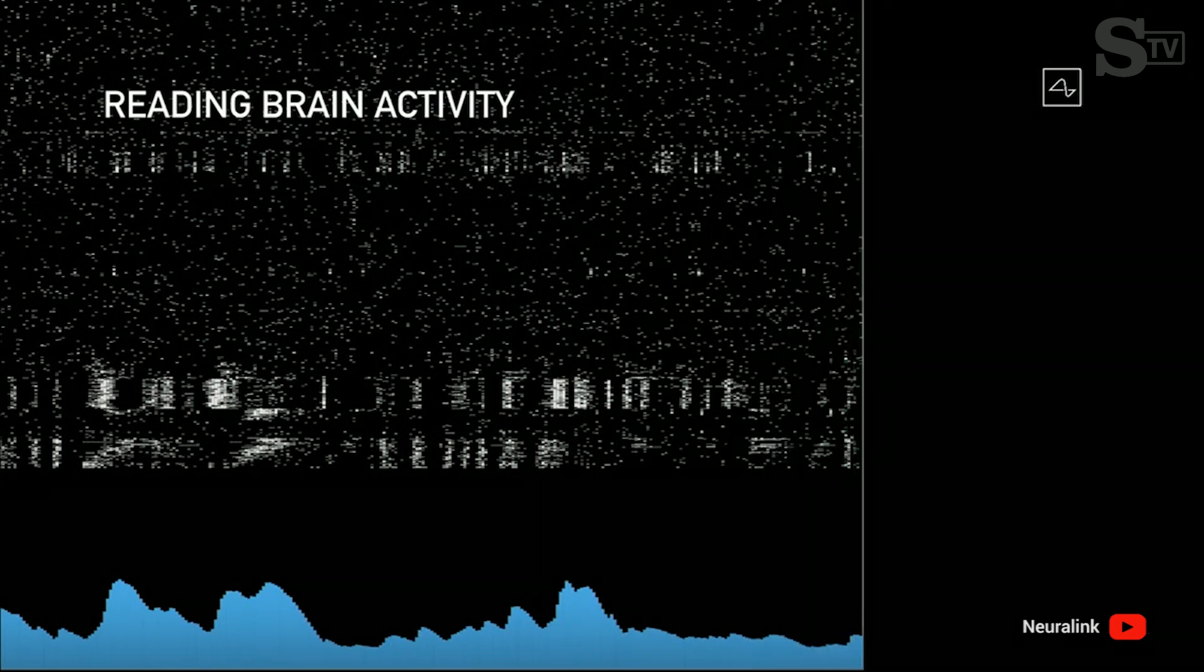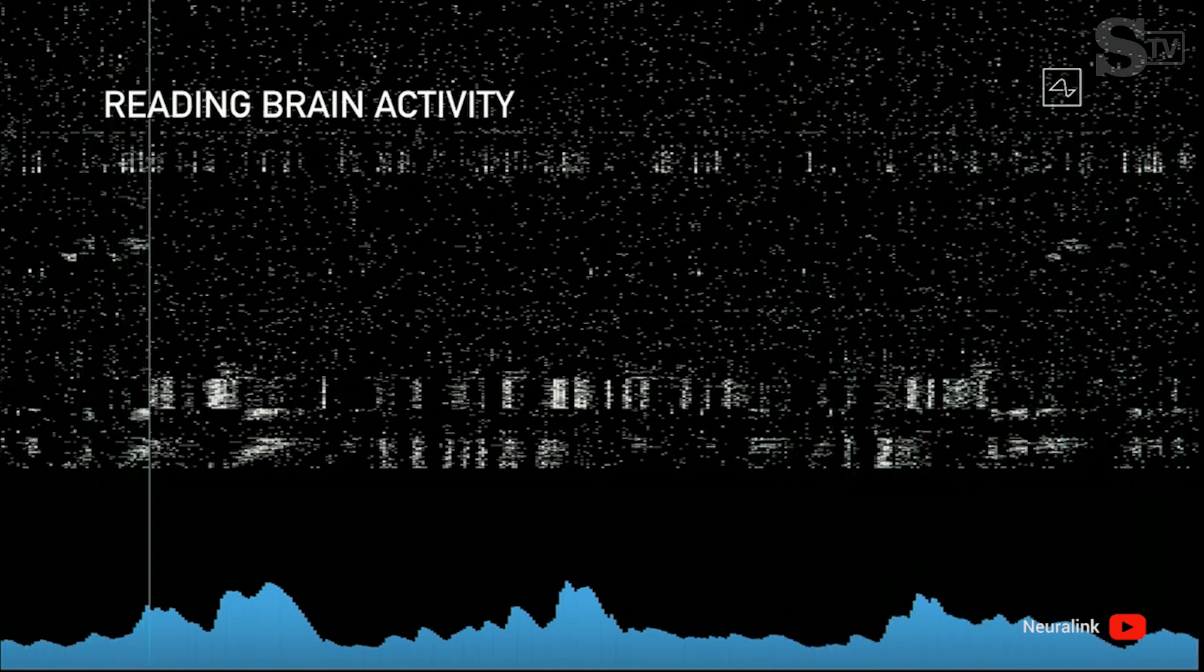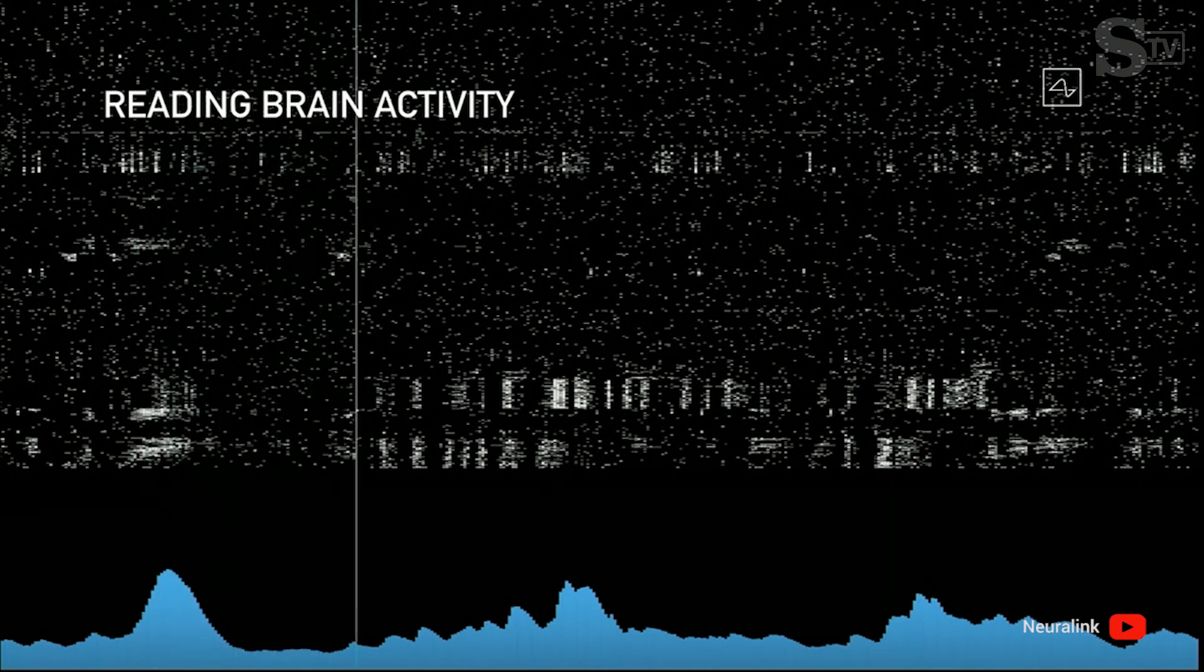Each of those dots represents a neural spike, and the blue chart at the bottom is showing an accumulation of neural spikes in that region.